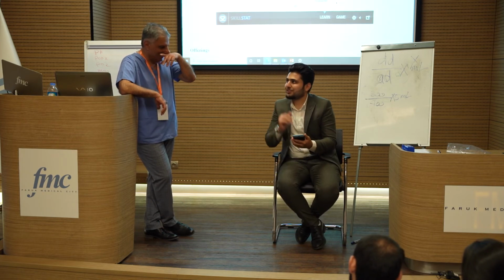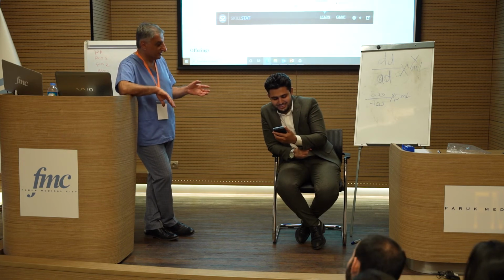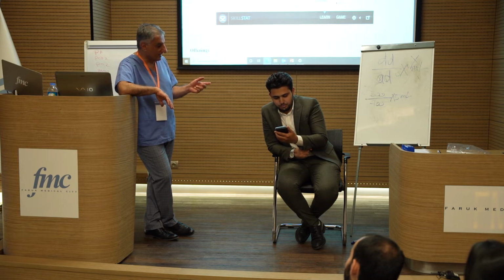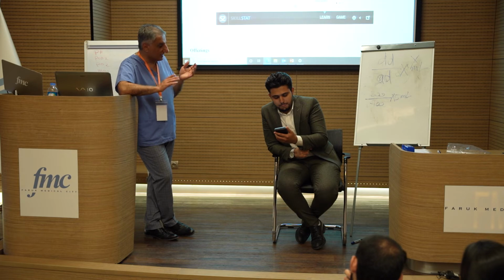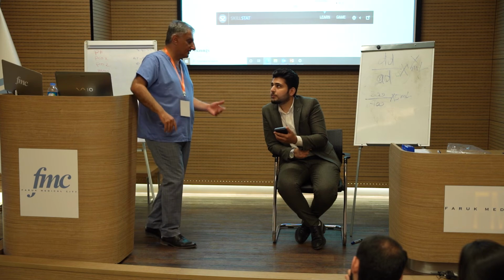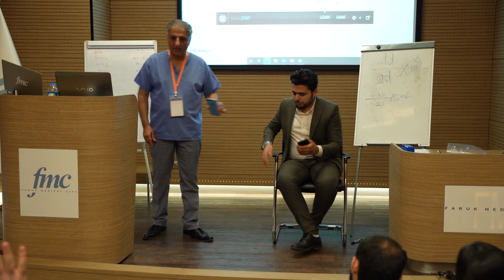So I'm going to repeat it, okay? Now, what have you gathered from the information? As far as I understood, it was regular, 54 the rate. Regular, 54, associated, and normal QRS. So this is bradycardia, I think. Yeah, so sinus bradycardia, because it's associated. Thank you. Yeah, go on.